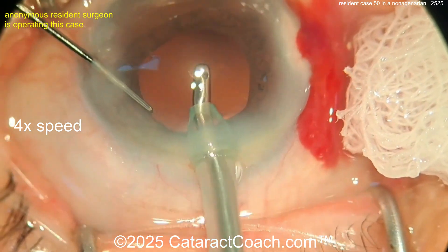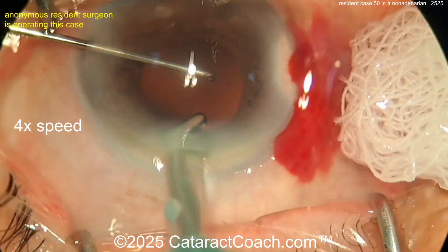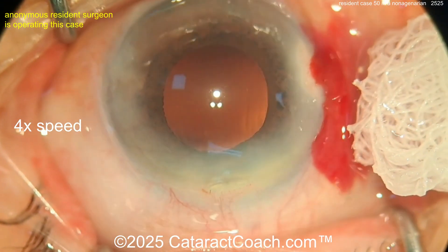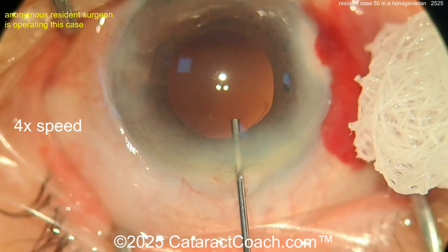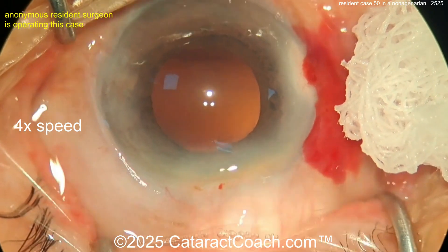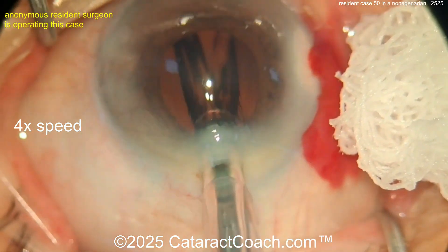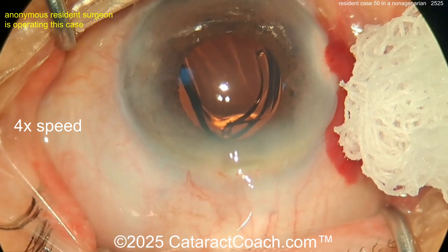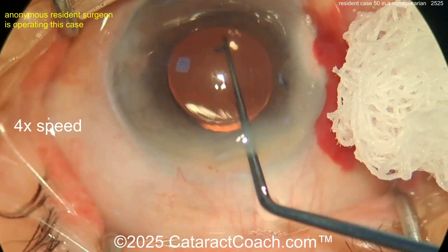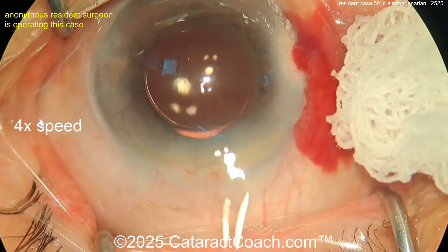I like the second-hand use of expanding the pupil and pushing it aside to improve visualization. At your level — case 50 — you're probably better off learning how to use iris hooks or a pupil expansion ring if needed. In this case I think you did a fine job without needing one, and I wouldn't put one in either. Here comes the cohesive viscoelastic filling up the capsule bag. There's a little iris prolapse — be careful. The lens is going in and delivering nicely. It looks like a single-piece monofocal acrylic lens — that looks great.